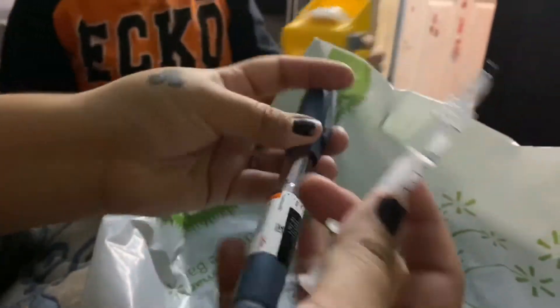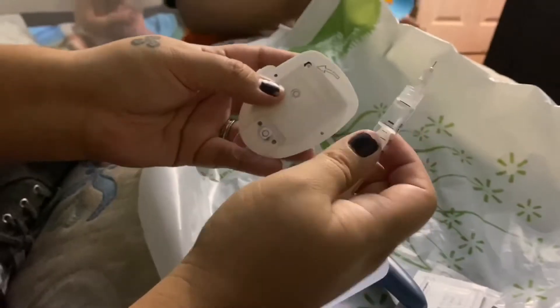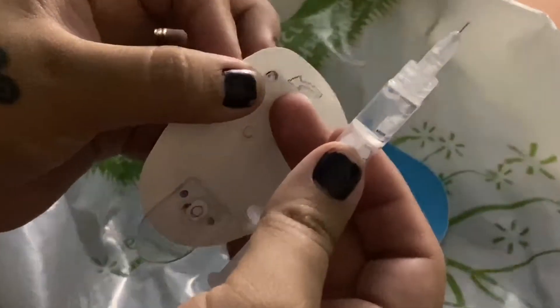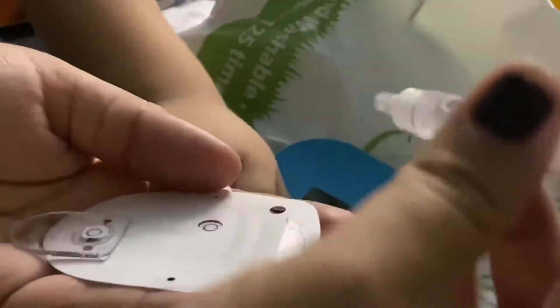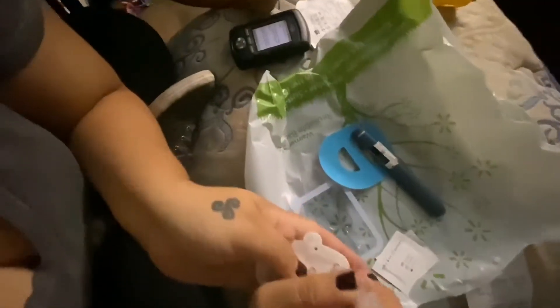Okay, give me your pump, honey. Now we are going to put all of this insulin into right here where the arrow is pointing at that little hole. I'm going to poke in there and start putting it in until it beeps twice.